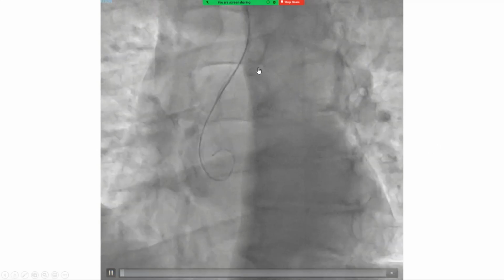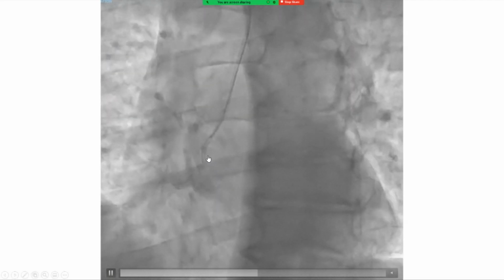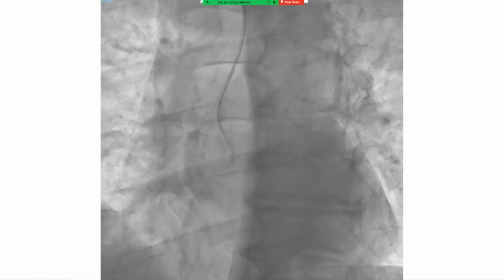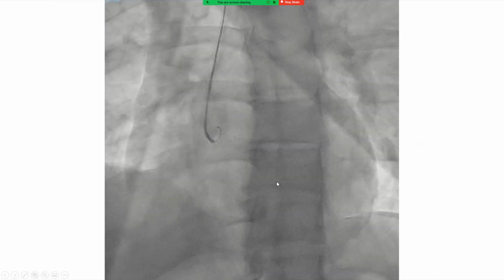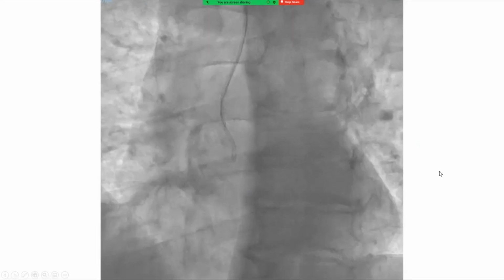This is another illustration. We're advancing the Amplatz left in an elongated fashion all the way to the right cusp. Now it feels stuck, so you have to pull a little bit above that cusp and maybe give it a slight torque, counterclock here, and make it free and elongated onto that right cusp. You have to be onto the right cusp, the cusp of interest. So we reached the cusp of interest and we made it free here.